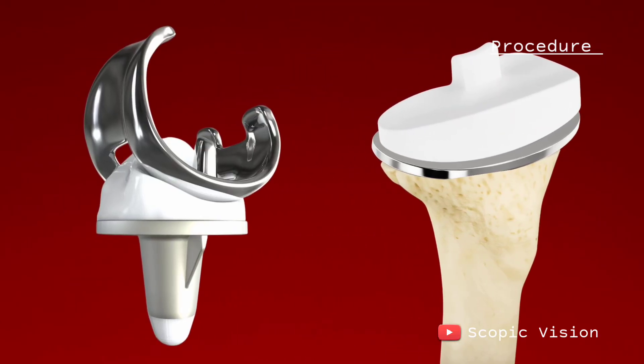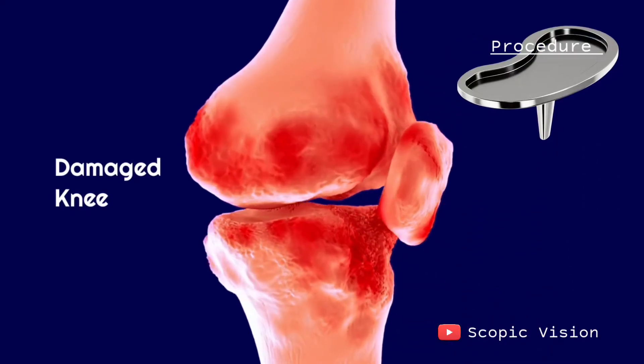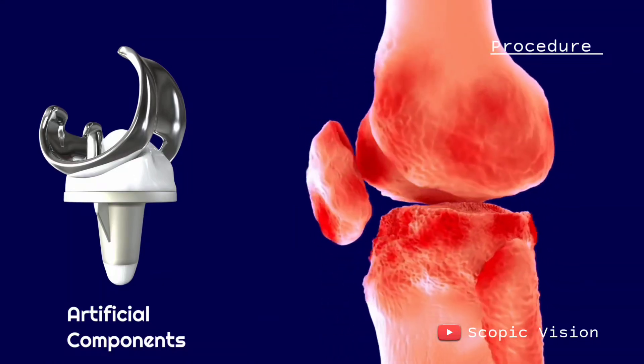Between these two metal components, a plastic insert called the articular surface is placed. This acts as a cushion, letting the new joint glide smoothly and carry your body weight just like healthy cartilage used to.